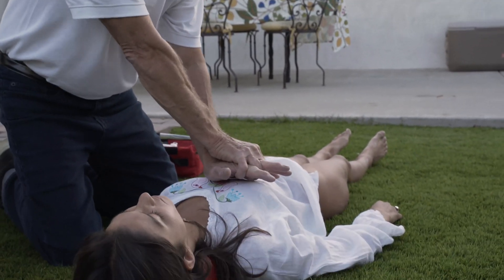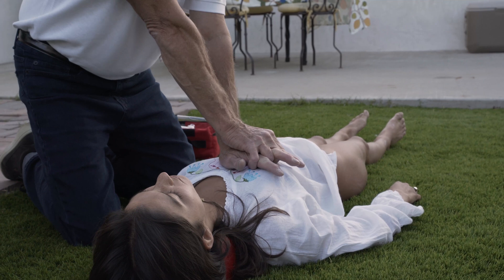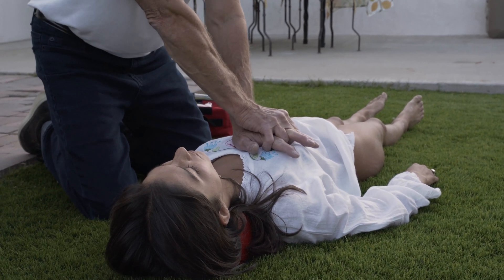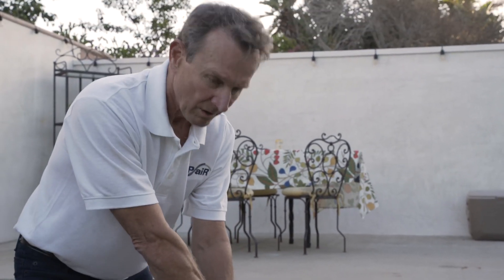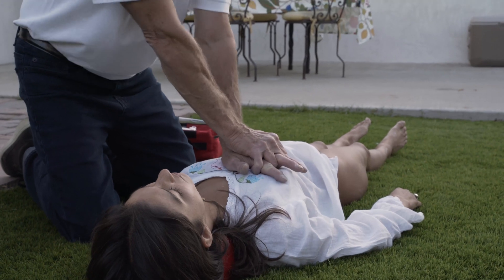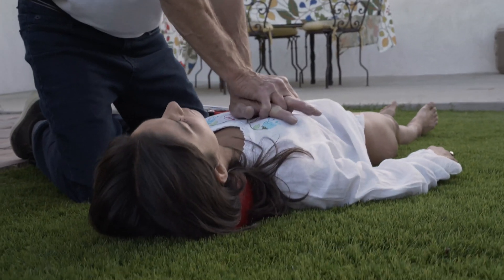Take both hands, one on top of the other with fingers interlaced, and place the heel of your bottom hand in the middle of the person's chest. Be ready to push hard and fast every time you hear 'press.' Get ready to press... The device will then audibly cue each compression in sequence.